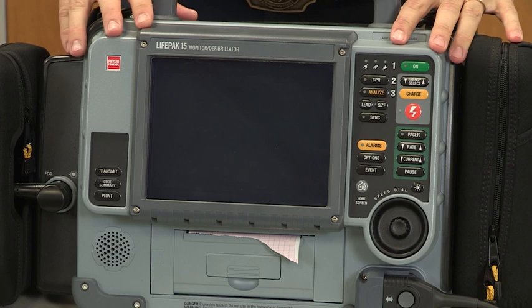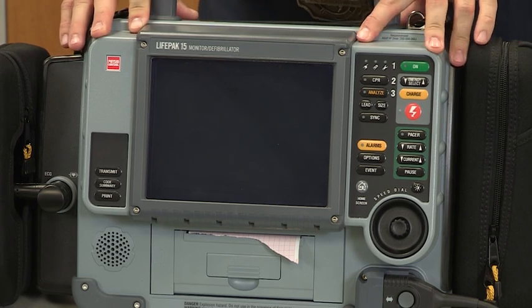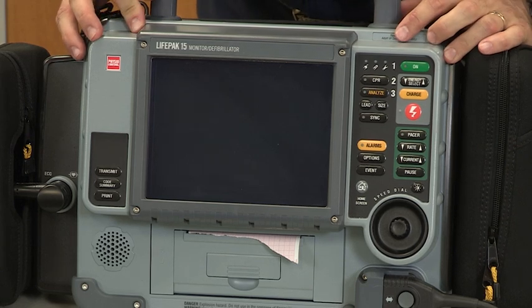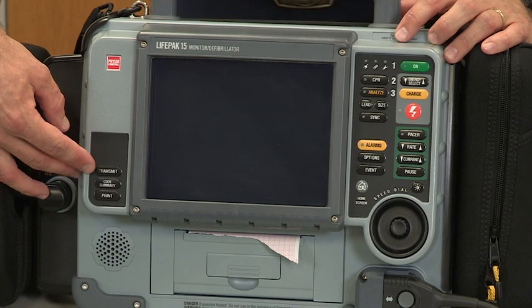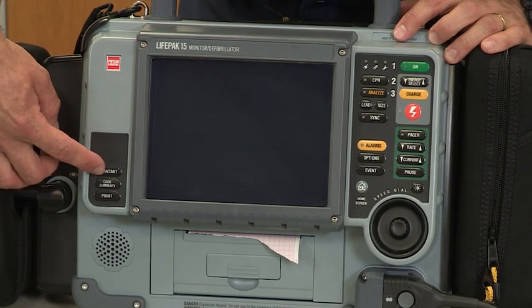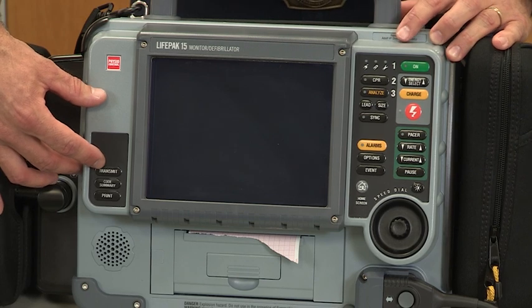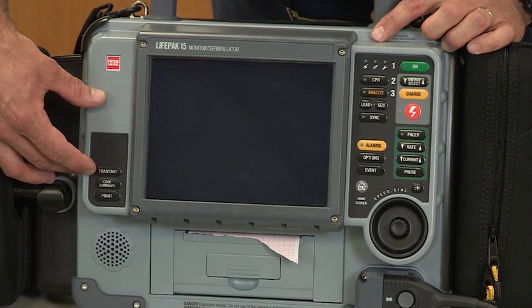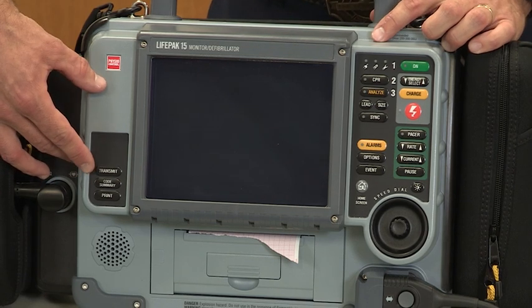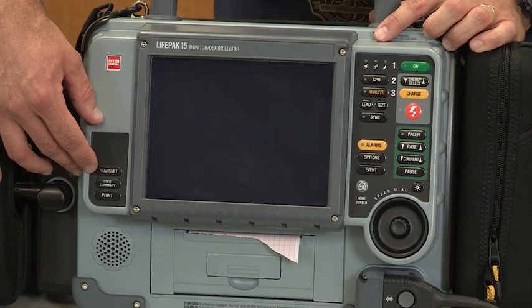Now I want to talk about a couple of the buttons that we haven't spent a whole lot of time on, some of the features that we're not going to be using on the LIFEPAK 15. I'll start over here on this side. You've got the transmit button just like we do on the LIFEPAK 12. This button is actually for transmitting things such as 12-lead tracings directly to the hospital once the machine's on and we've actively obtained a 12-lead. However, since we don't do 12 leads, we're not going to be transmitting anything to any hospitals.